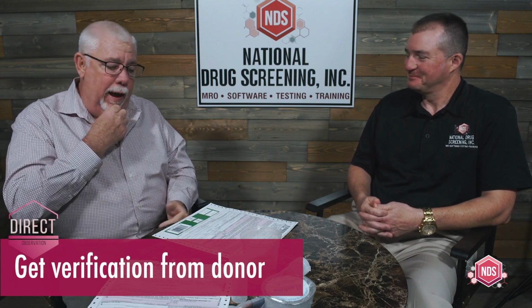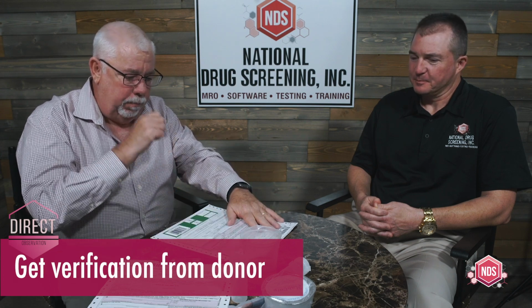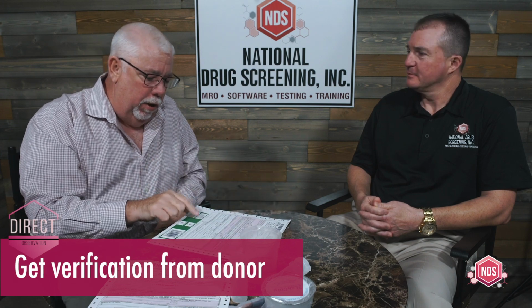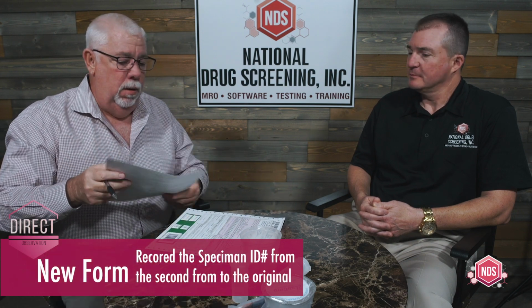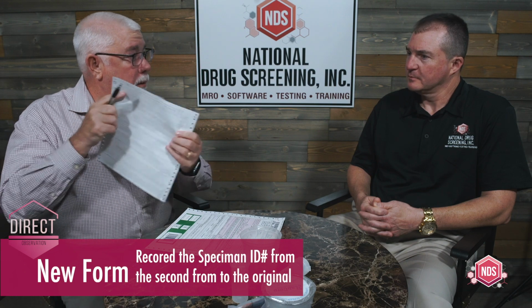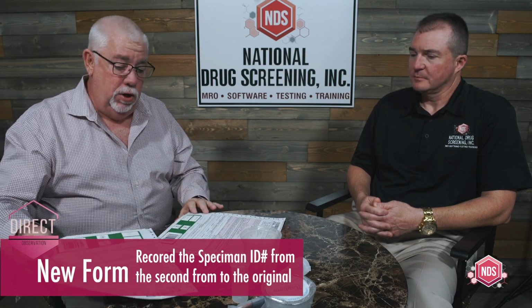Okay, so again, I'm going to finish this whole process on this first specimen. One of the things I'm going to do is reference the specimen ID number from the next form that I'm going to be using for the next test, which is the one under direct observation.